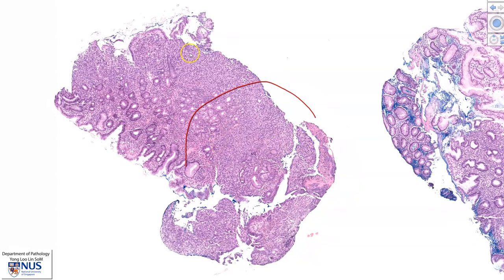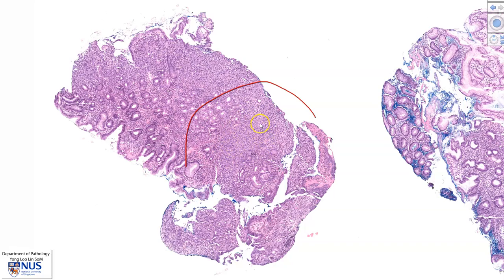Going back to low magnification, these are the normal benign gastric glands. In some areas, such as this area that I am outlining here, there appears to be a disruption of these glands. We can see them again here, but not in this area — this is where the tumor is.